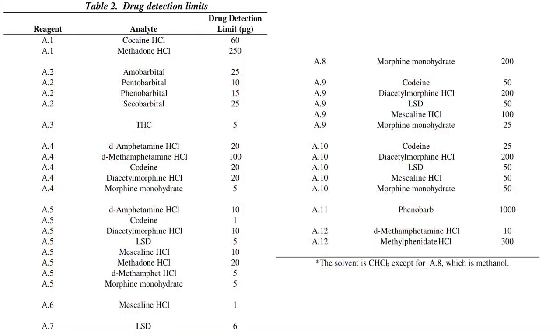Another important thing to note is that these reagent tests do require a minimum concentration of the drug to be present in order for the test to work. Some of these tests are very sensitive, while others are less so. If the drug is present in concentration below these limits, the test will not give a positive result.